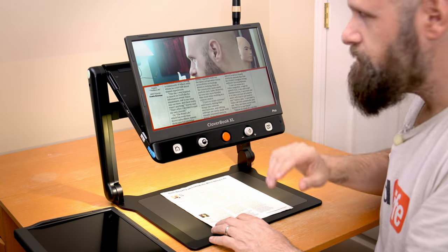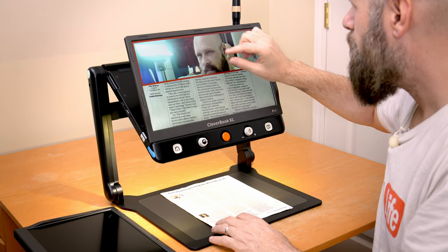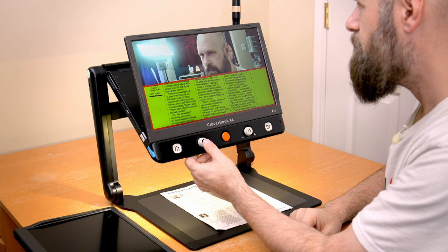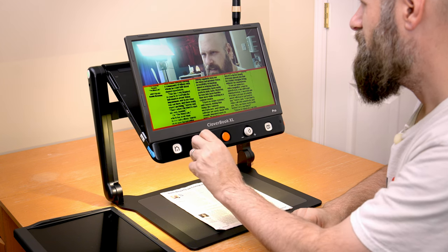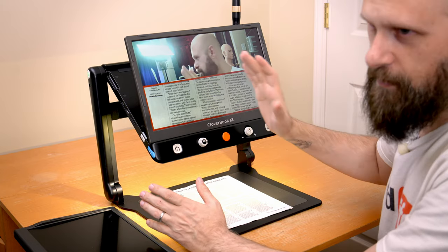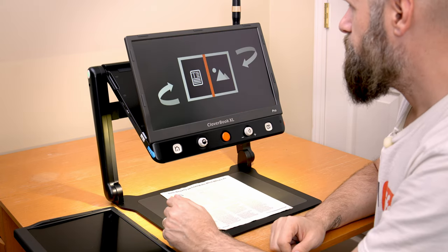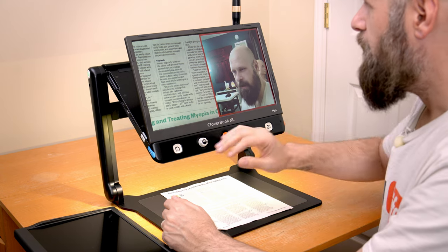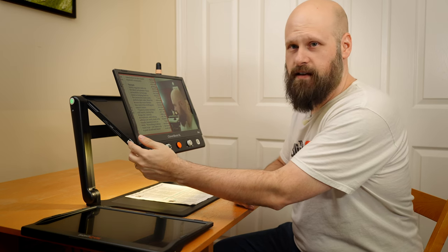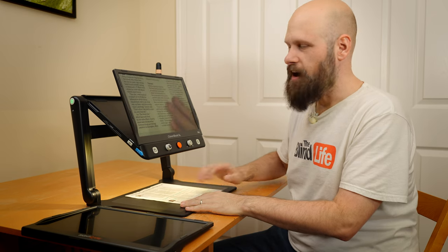I can interact with each half of the split screen — I just tap on the area first and then zoom in on that spot or change colors. The layout can also be in landscape, with the document on the left and the distance camera on the right. Pressing the button one more time goes back to just the document camera.